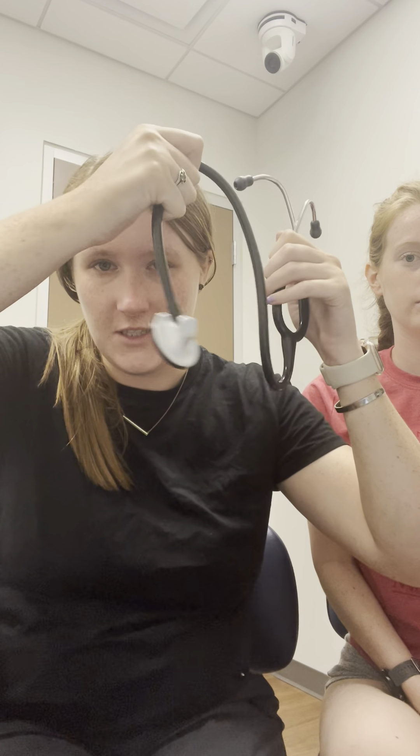This is my lung and heart video. You need a stethoscope. You're gonna be checking the different lungs and it's kind of an awkward space.